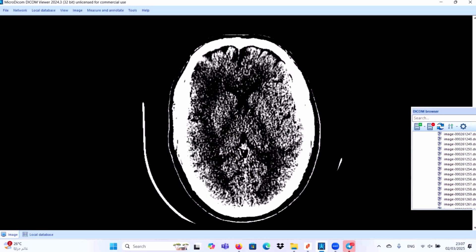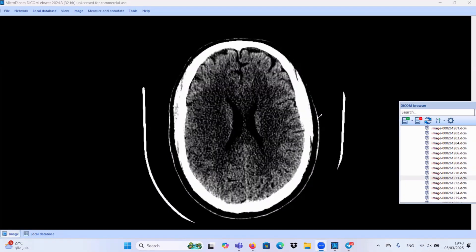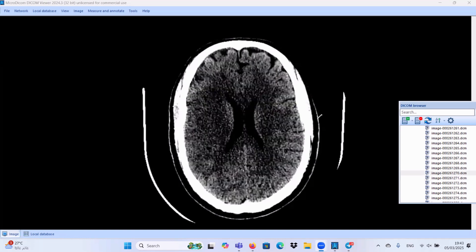It is more obvious. Let's concentrate on the basal ganglia area. This is the lentiform nucleus, this is the caudate, and this is the thalamus. I think more or less symmetrical in their densities, so we don't have loss of definition of the basal ganglia.